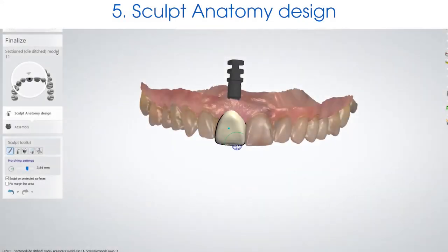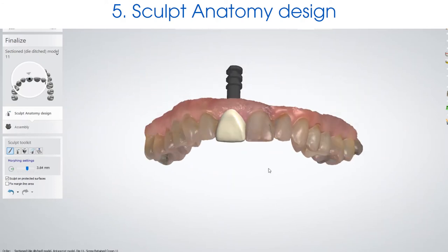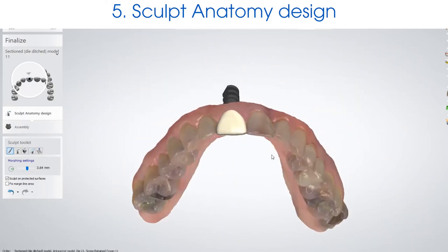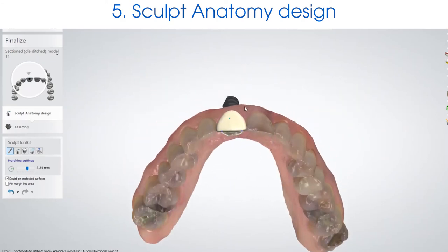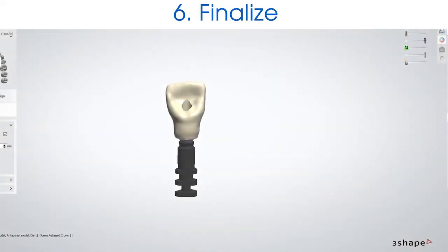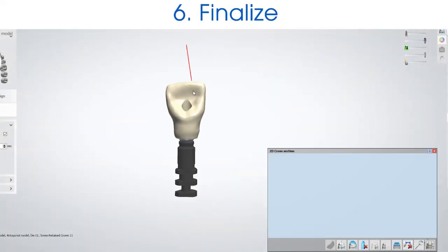Step five is the final sculpt anatomy design. This is where your crown connects to your emergence profile and where you can make small adjustments. The final step is finalizing your crown.